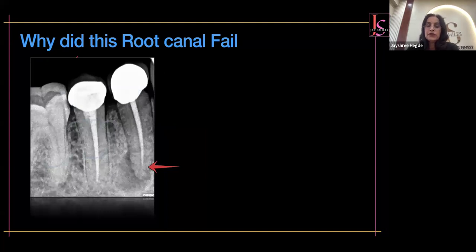And again, most of us feel good when we have an obturation like this. And if you compare this obturation with tooth number 4-5, this is 4-5, which the arrow is pointing at 4-5, and then you see a 4-4, arrow is pointing at 4-4, and you see 4-5. What is that you see here differently? You see the size of the apical foramen.